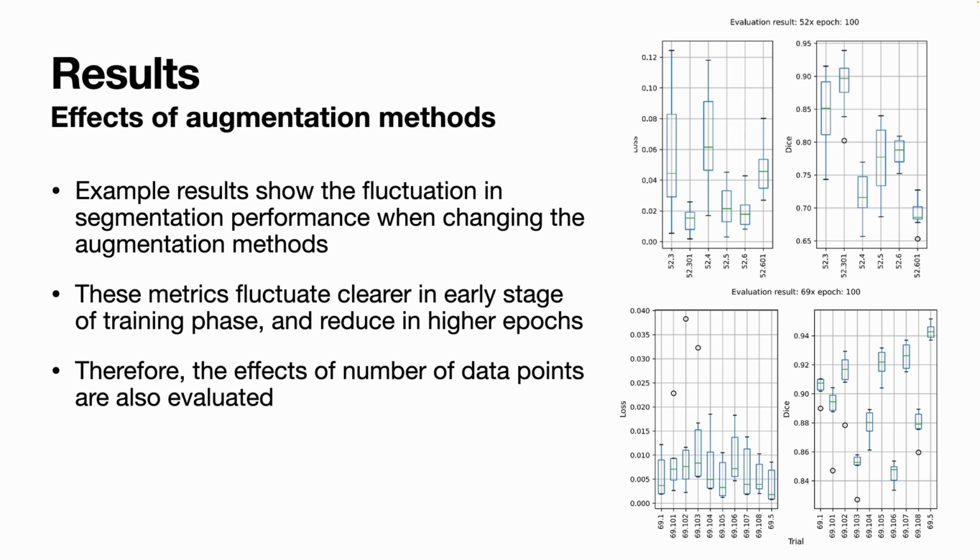The next three experiments are to optimize the segmentation performance to have a better assessment and to see whether the image augmentation correlates with the segmentation performance. It is necessary to carry out the experiment with different augmentation methods and their corresponding parameters.